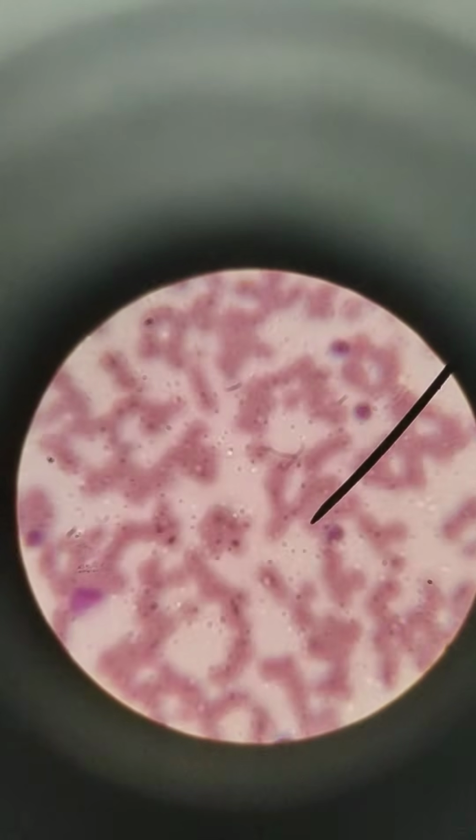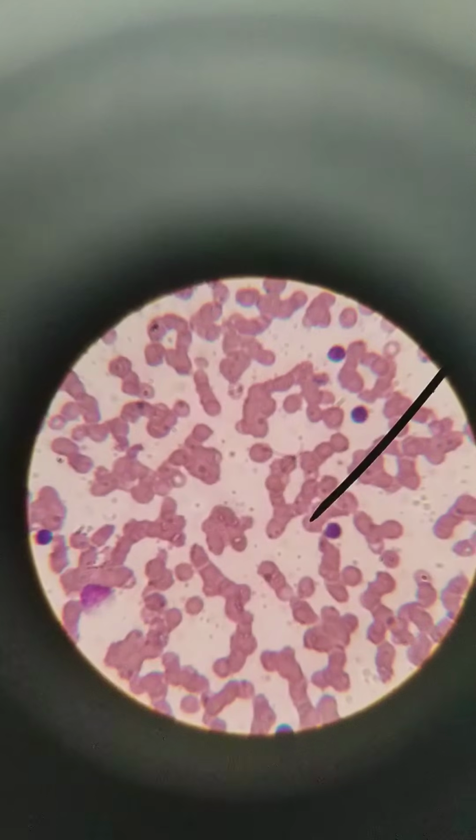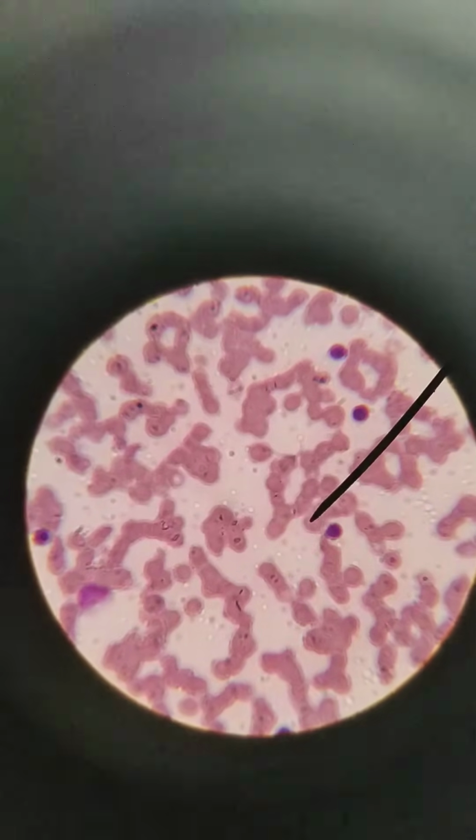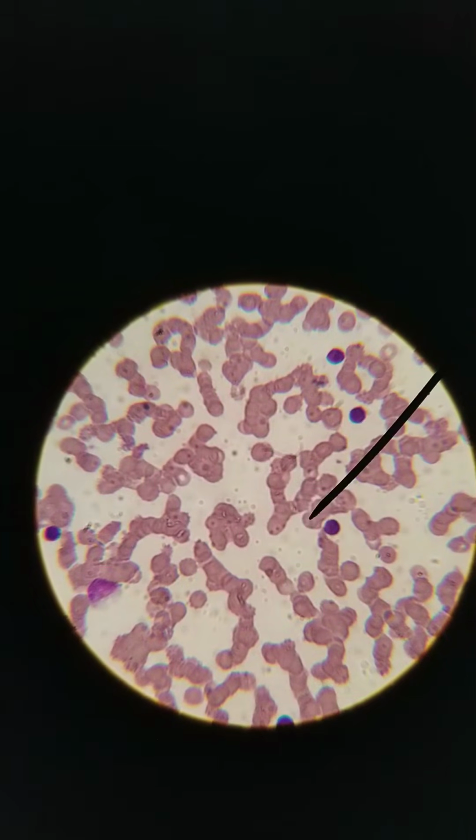And finally, we have another type of leukemia. Let's see what we see on this one. Again, lots of red blood cells, sometimes in stacks called rouleaux, French for rolls or stacks.